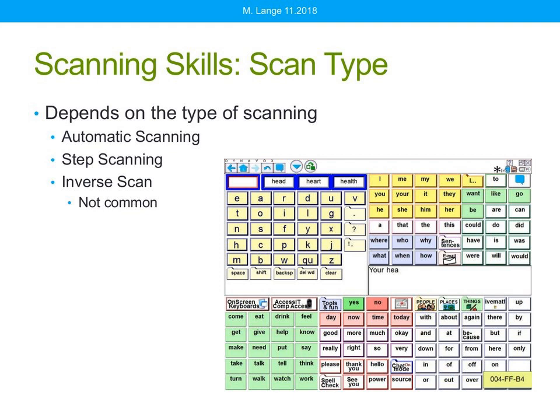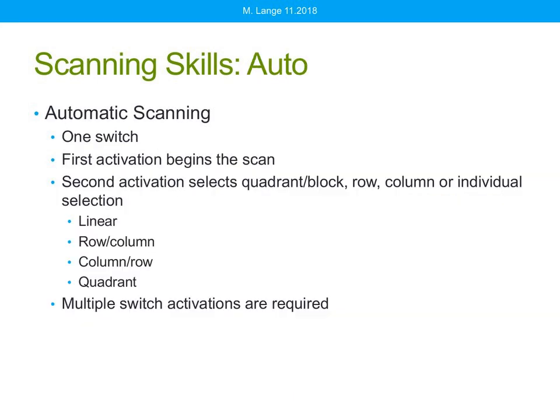The display in this picture here has a tremendous amount of vocabulary on it. How it's organized is very, very important, and the strategies that we provide to help the client move through this information are also very important.